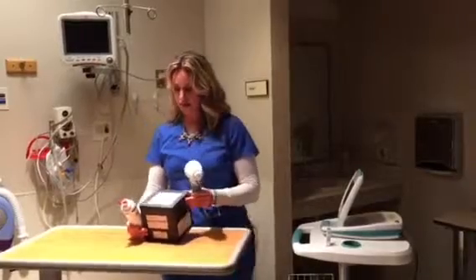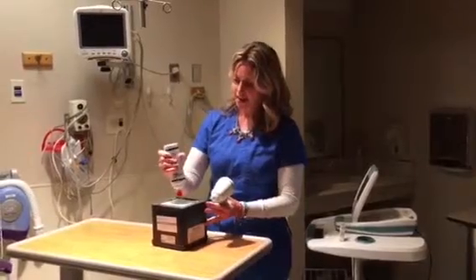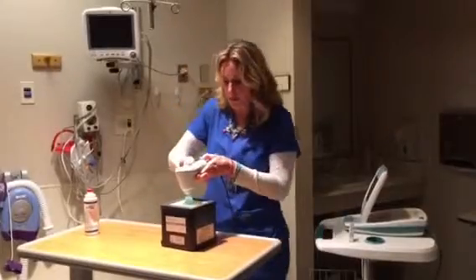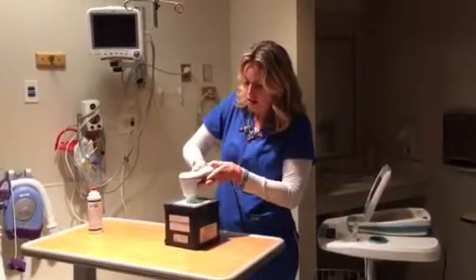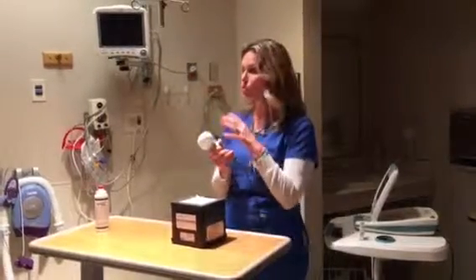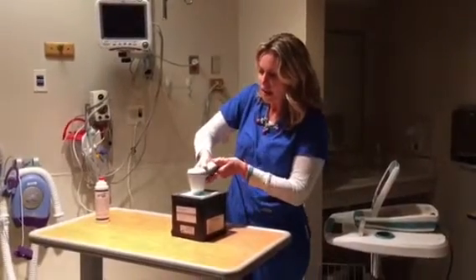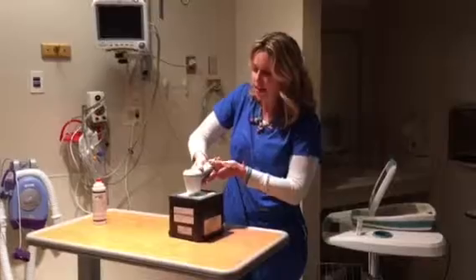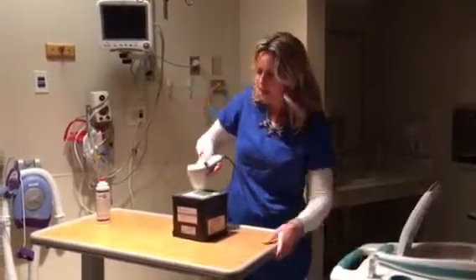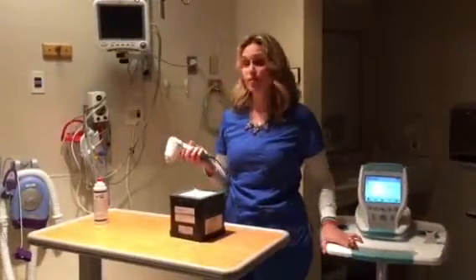Now here's my patient's head to the left, feet to the right. Patient's pubic bone is here, and I'm going to place my gel, and it's going to be a nice dollop of gel here. The reason is I'm going to place the probe just up and down, and I want the gel to be hitting this white case, so there's enough room for all of the gel to completely cover the probe. And I'm just up and down, and I press and release. And I can feel the picture being taken on the handle here. And I have 8 arrows flashing, and I have the bladder and the crosshairs. So you can move on from here.